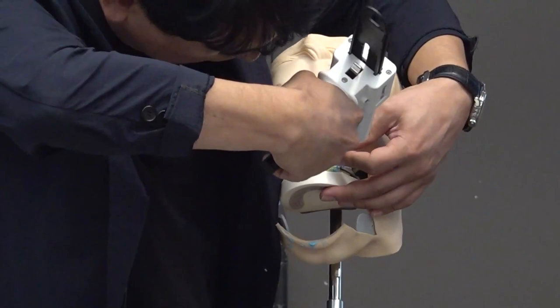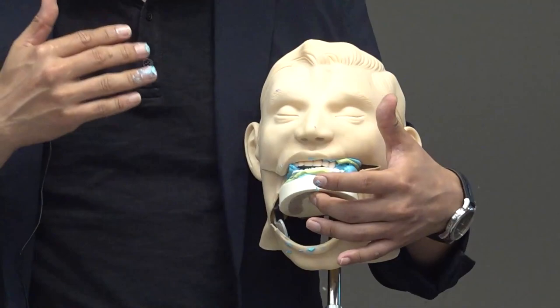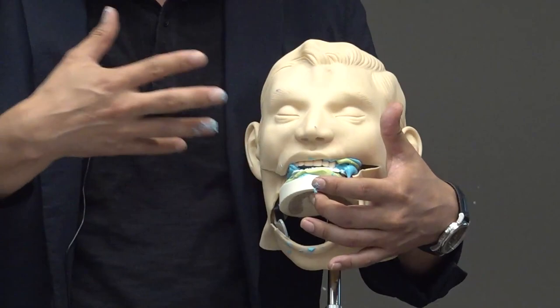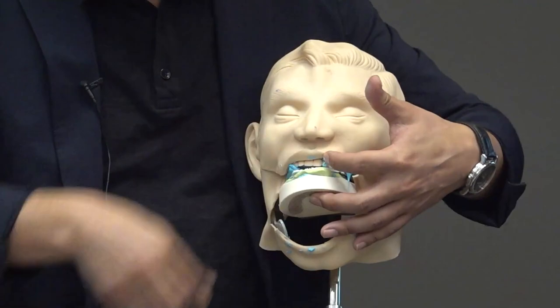That's all. That's finished. To be honest, in our hospital, my hygienists are doing this procedure. I only check the proper vertical dimension and CR. The other procedures are done by the oral hygienist. So it's a very simple procedure. And then if you need the pop-up, you have to remove these six teeth and put the handle, and then I will show you.